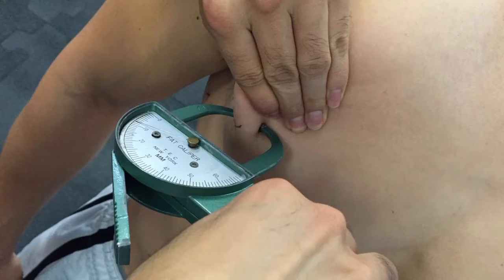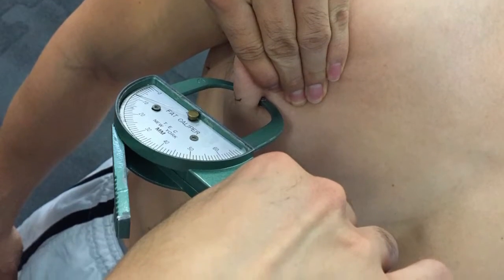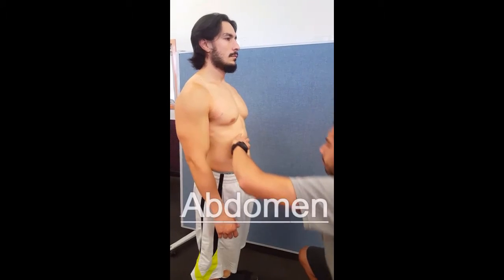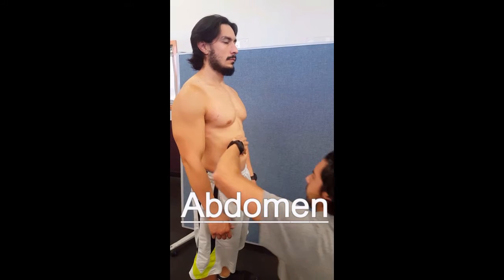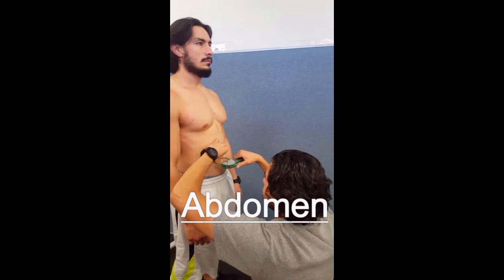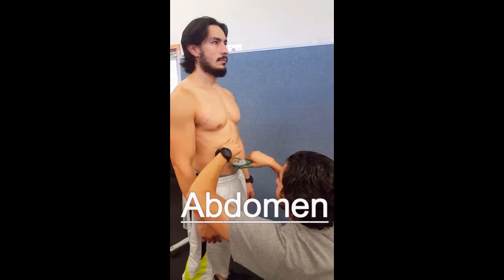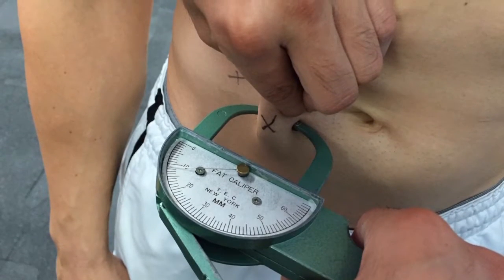Next up, we have the abdomen or the abdominal area. It is a vertical fold, and it is two centimeters to the right side of the umbilicus. In the picture, you will notice that the caliper is surrounding the X, which marks the spot.